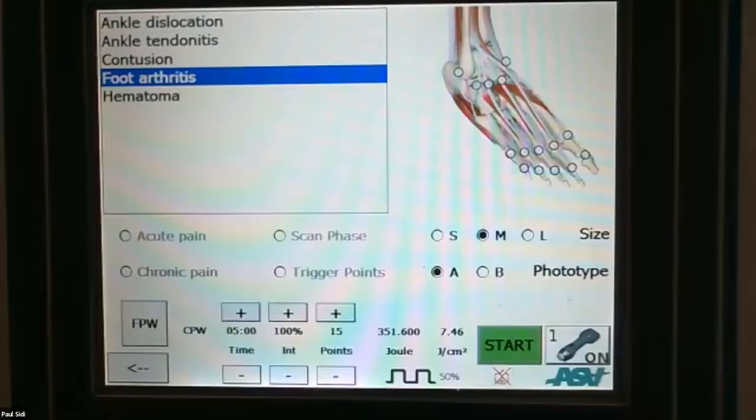That is basically it as far as I'm going to show you with the handpiece. Let me just very quickly show you how simple it is using the Charlie head. So I'll just come back here. If you've got the Charlie head, this is. If I get back on there.